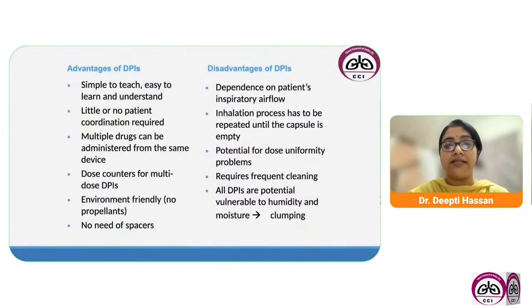So the advantages are it is simple to teach, there is little coordination required. Multiple drugs can be administered from the same device. Dose counters are available for multi-dose DPIs. It is environment friendly and there is no need of spacers.